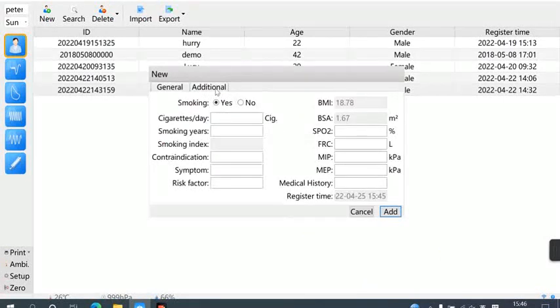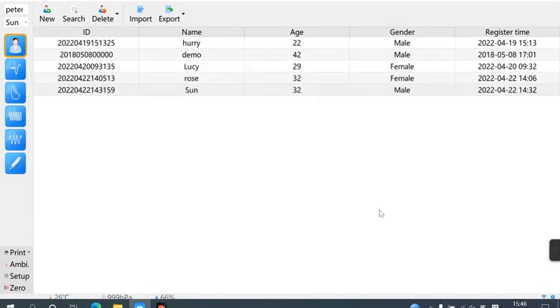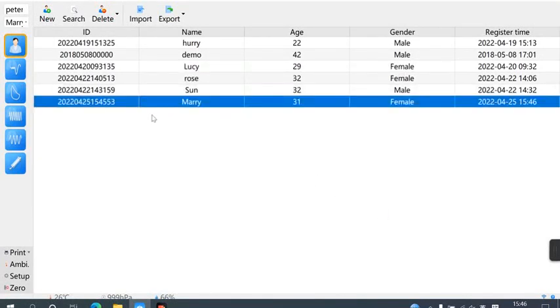Click Other information to fill in information such as smoking or contraindications. If you don't fill it in, it will not be filled in by default. Click Add in the lower right corner to save the sample information. The new sample has been completed.